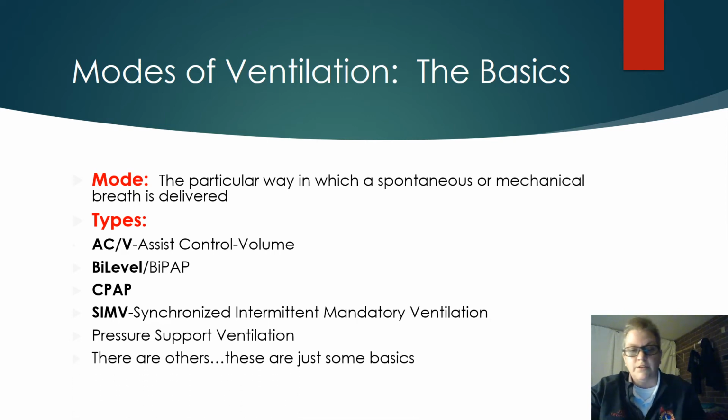So there's many others. There's using heliox, there's using nitric oxide. Sorry. So some of the basics that we're going to talk about.